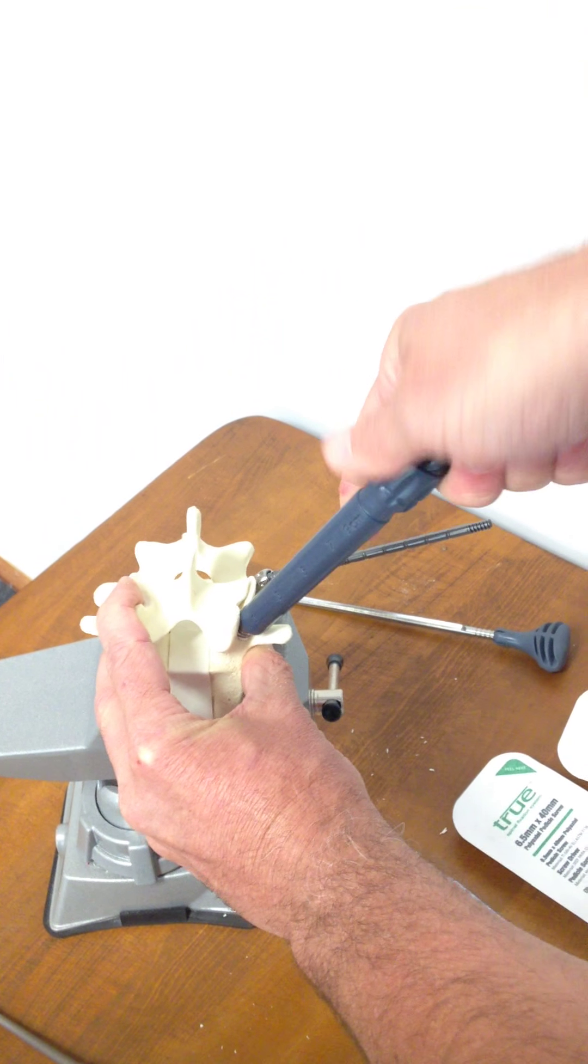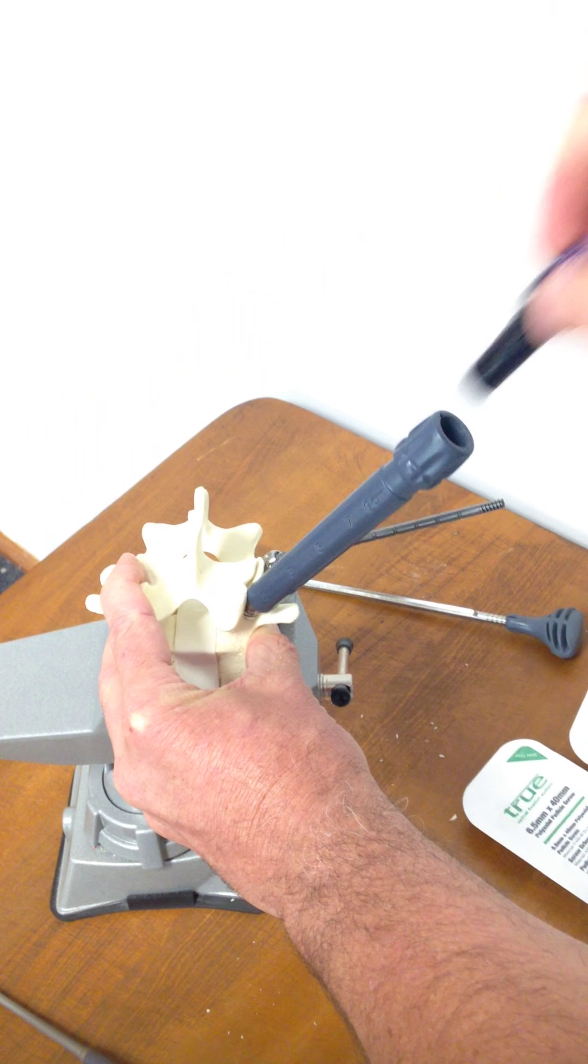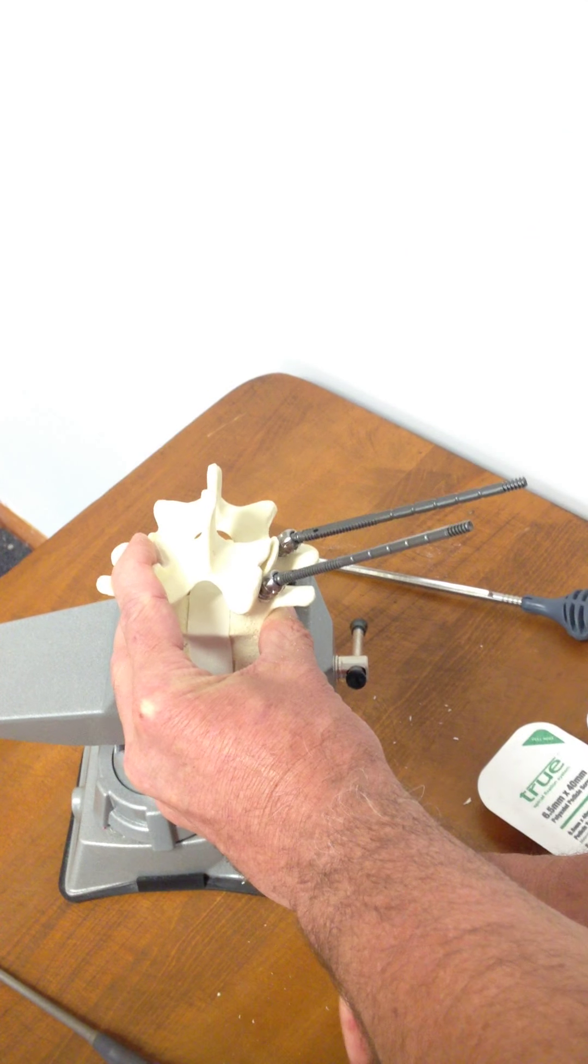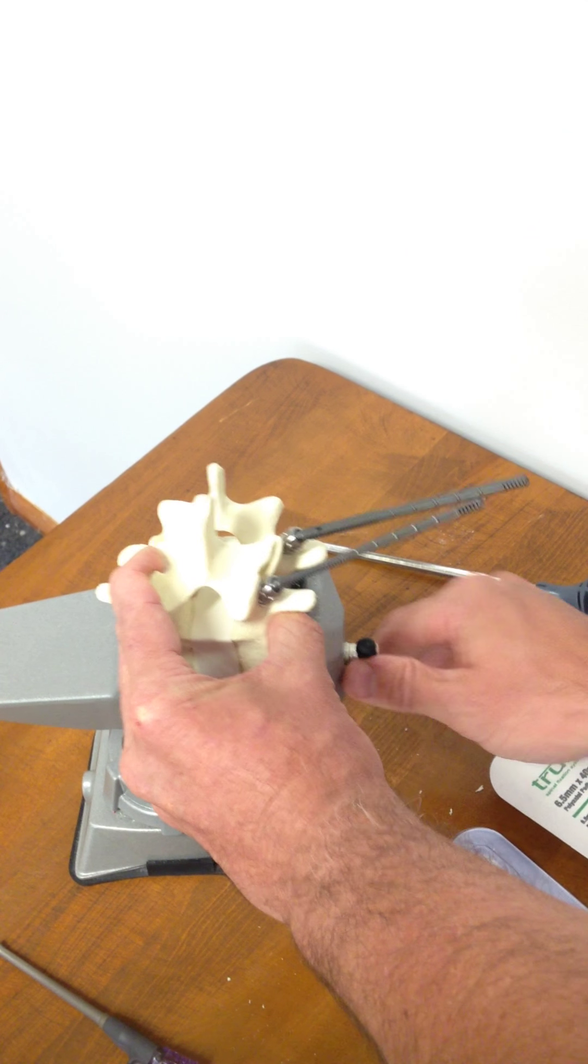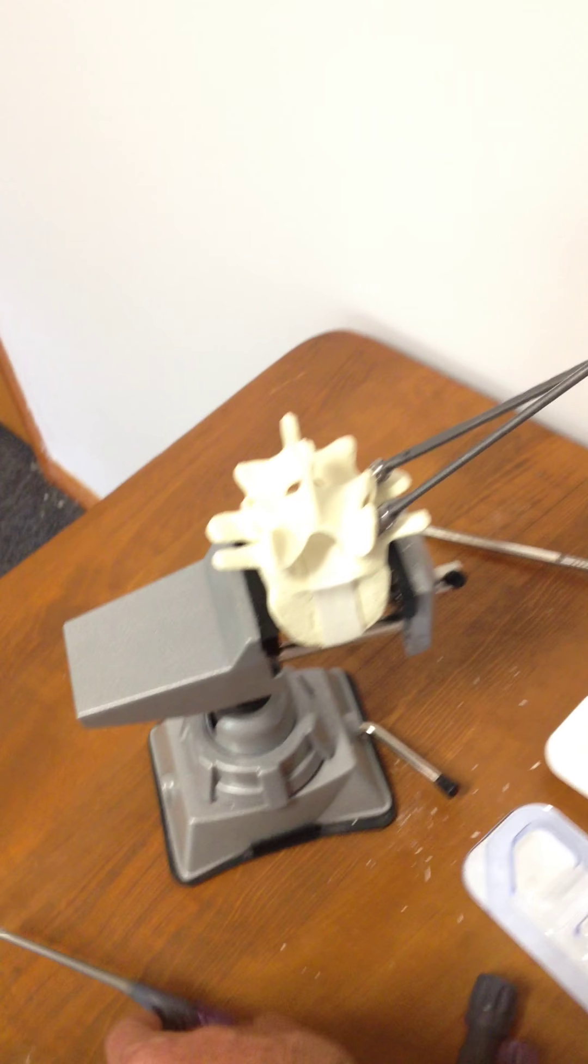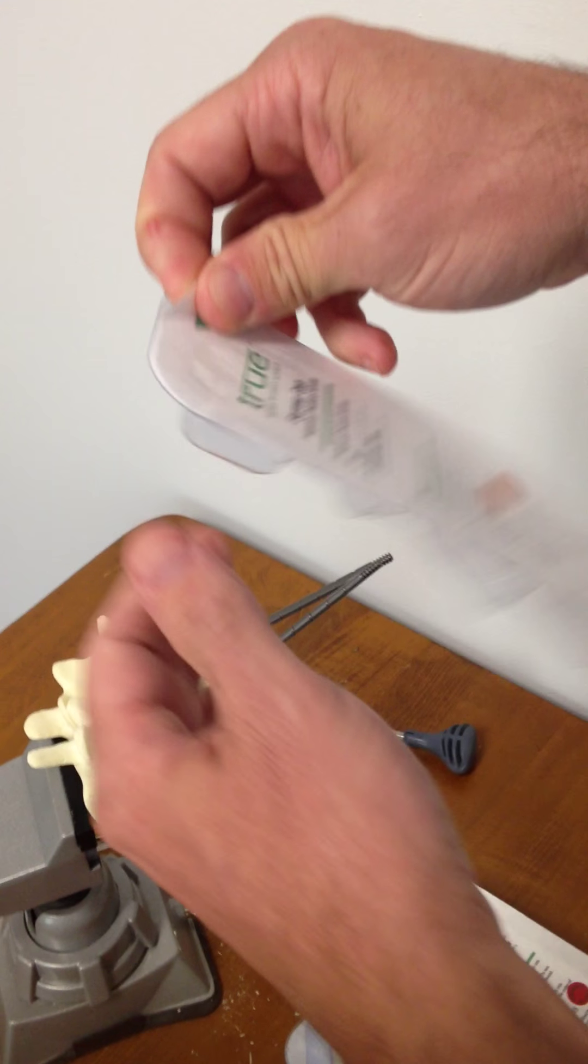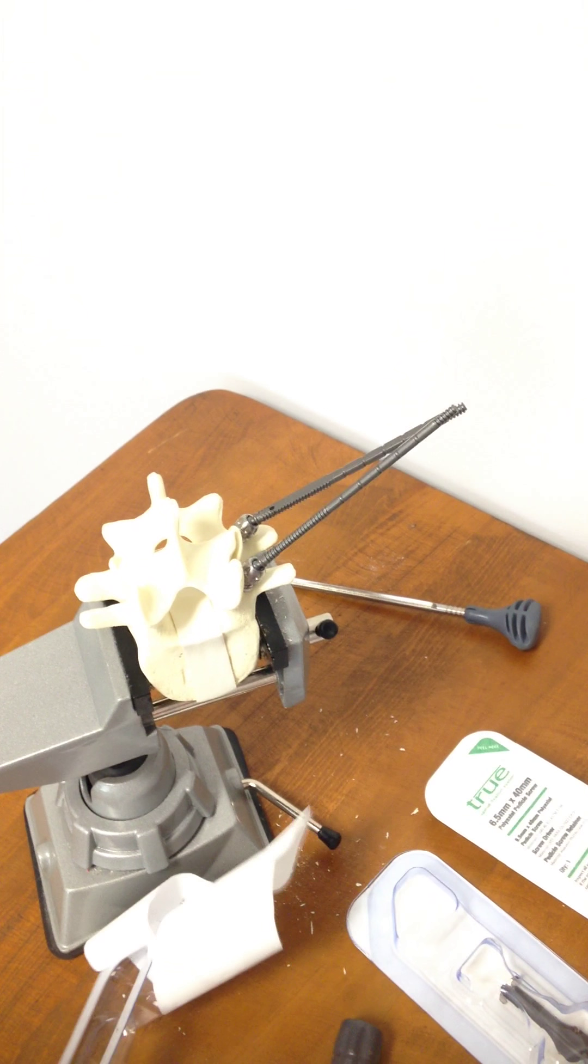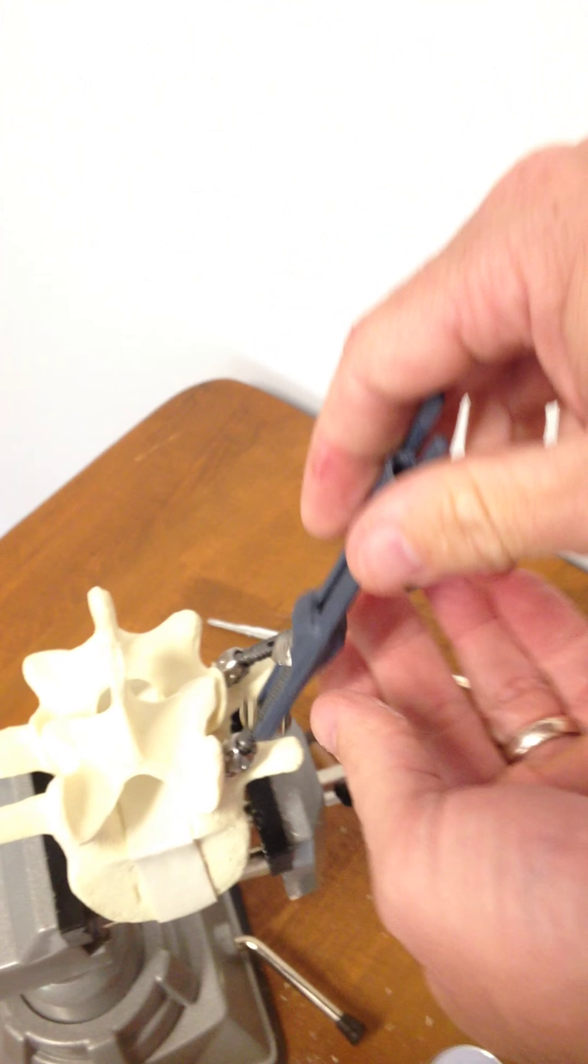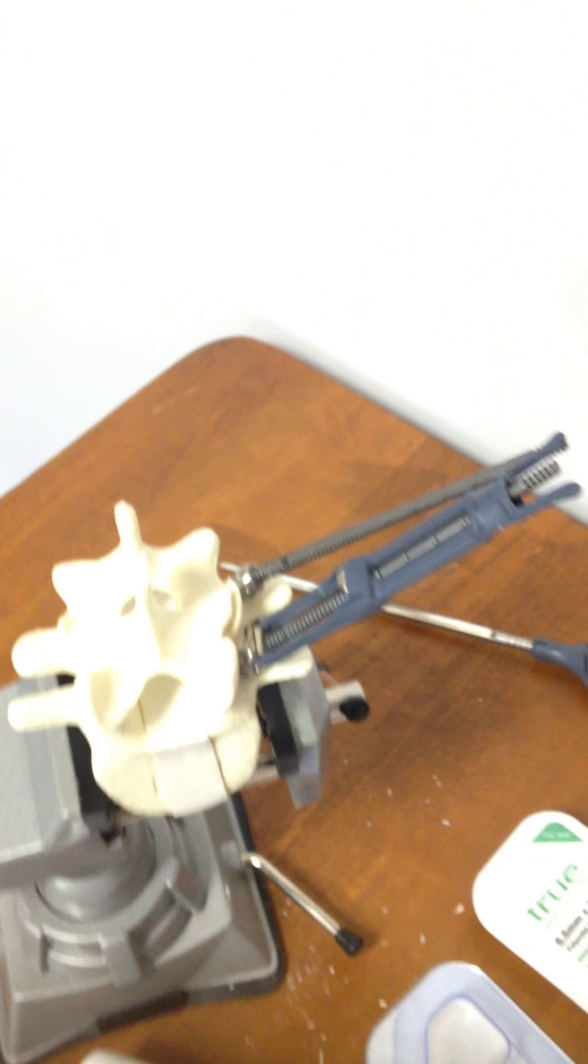And again, removal of the cap retaining cap, and then the delivery shaft comes right off. From the sterile tray, we're going to be delivering our caps back over our polyaxial breakaway shafts, and we'll put both of those in place.